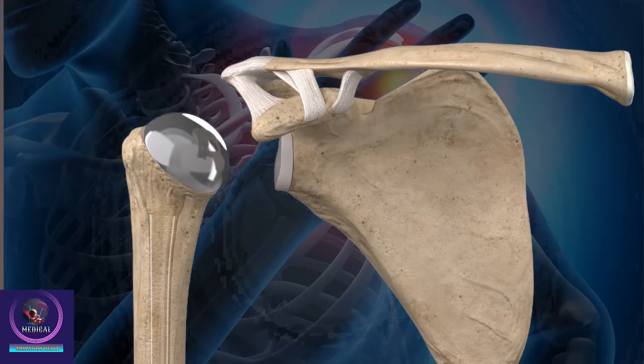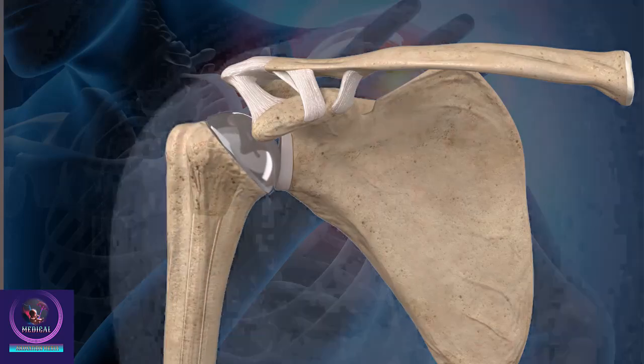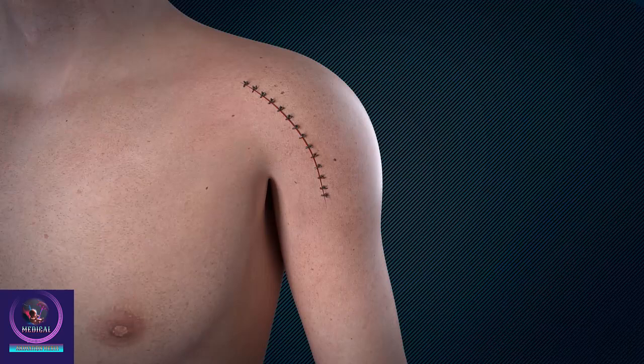Finally, the bones and implants of the shoulder joint are placed back into the proper position, and the incision will be closed with sutures or surgical staples.